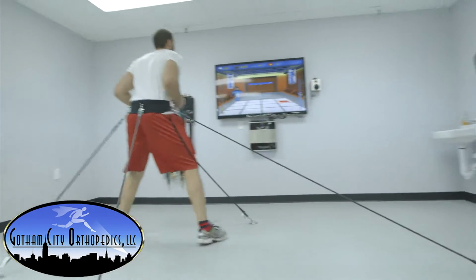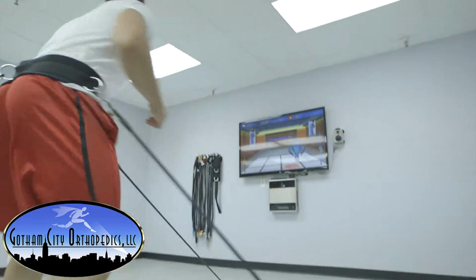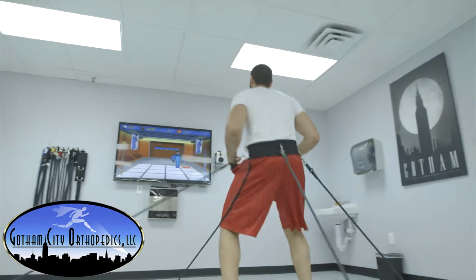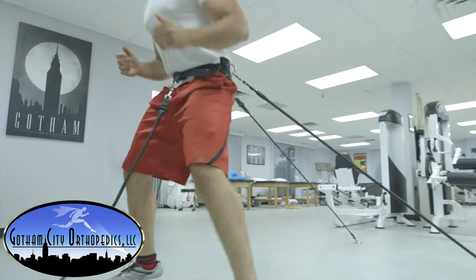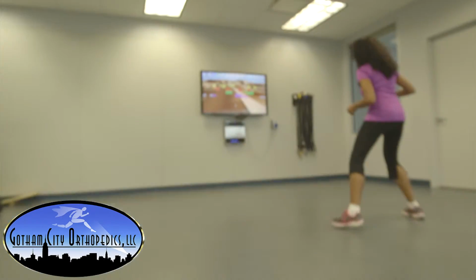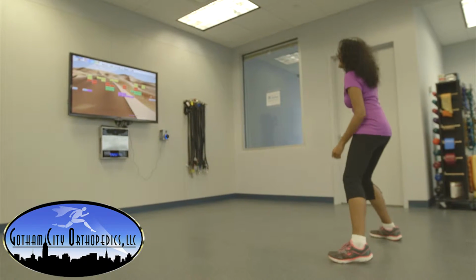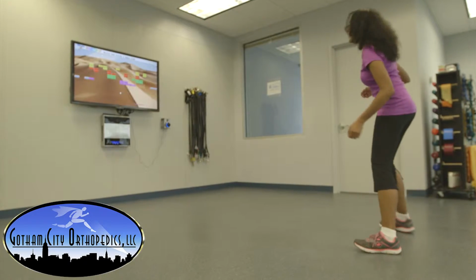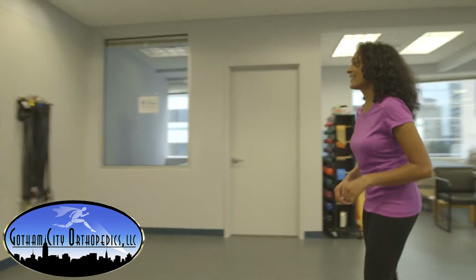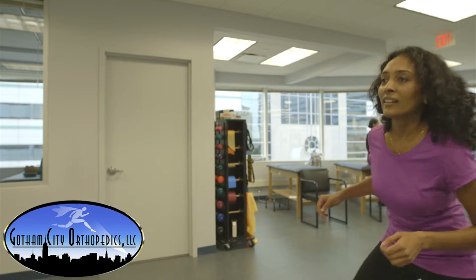The next is it'll take you through a bunch of different drills, whether you're running forward and backwards, side to side, jumping, and it can measure your acceleration, deceleration, reaction time, and so forth, and it gives you a composite score. The next is concussion management. We do baseline testing. This computer standardizes it. So they standardize your best test, and so by having the baseline Trazer test, we go through rehab, which they have 7 phases of concussion rehab built through Trazer.